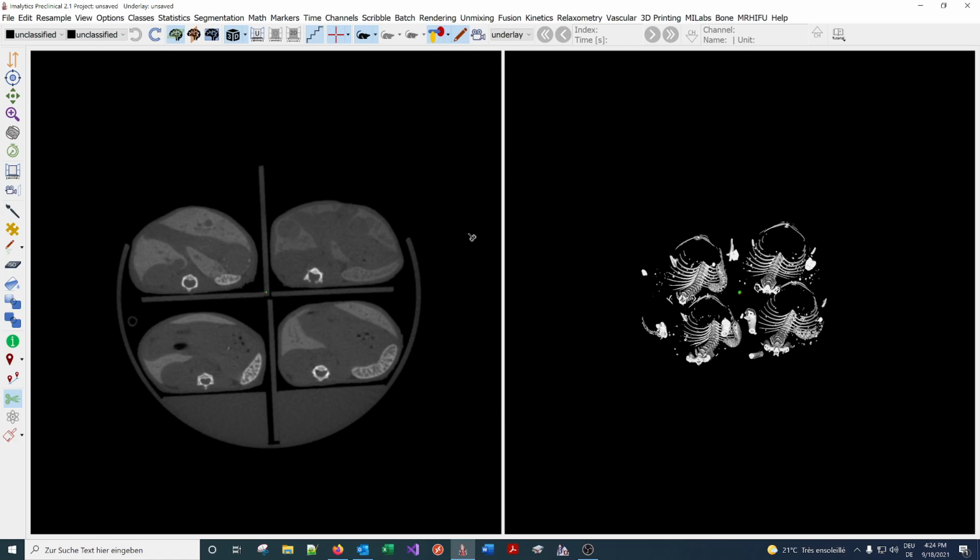Hello, in this video I'll show you how to crop images with the Imalytics Preclinical Software.